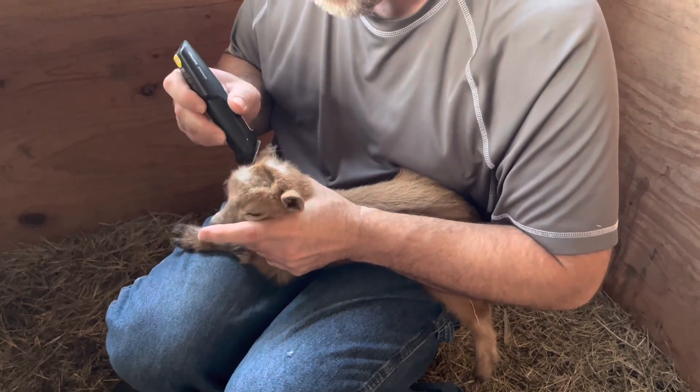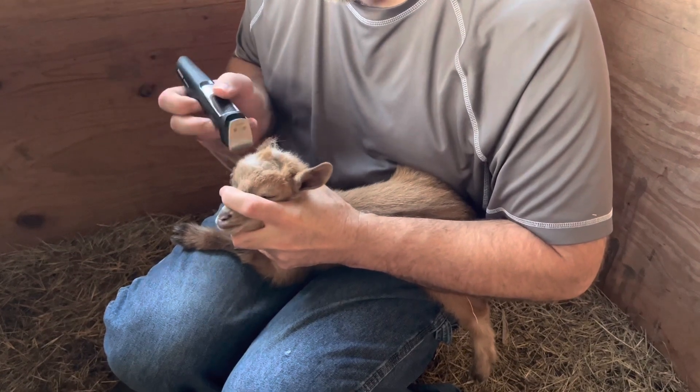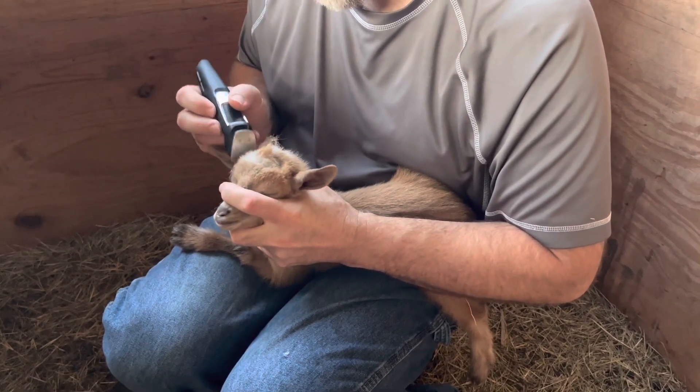He's just going to shave some of the hair off so that whenever he uses the disbudding iron it won't throw up quite as much smoke from burning hair.